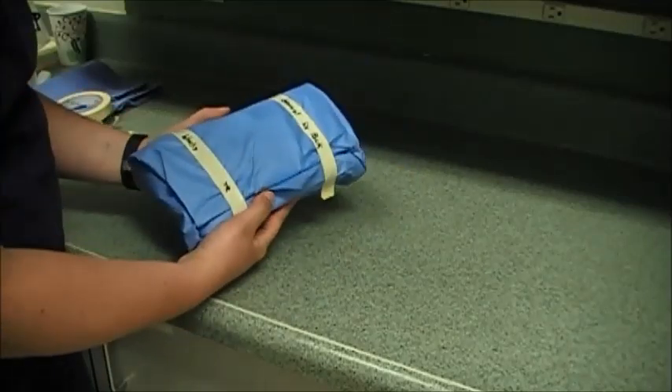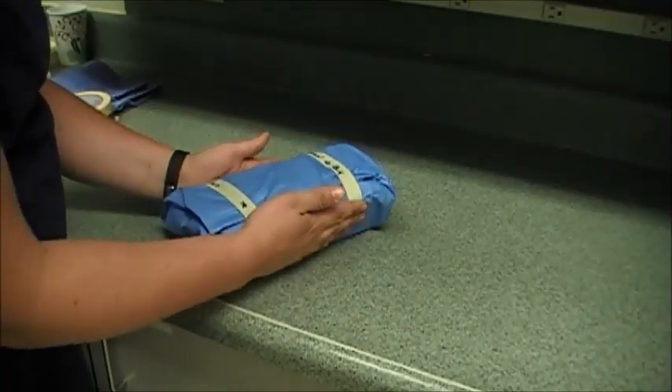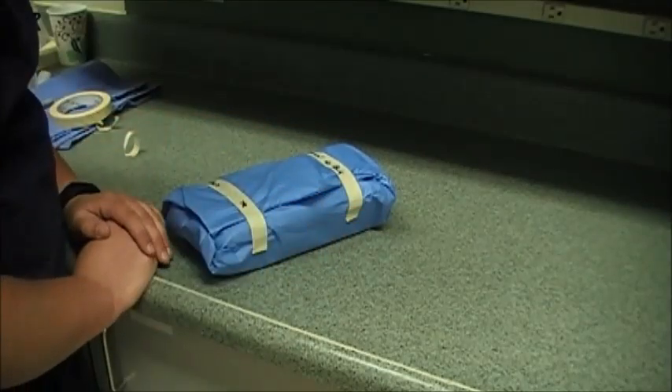Alright, and then here's my general surgery pack — it's ready to be autoclaved, and then we can check our sterilization, and it'll be ready for use.